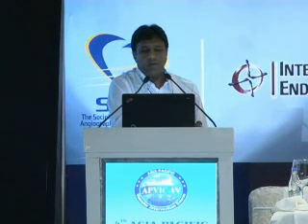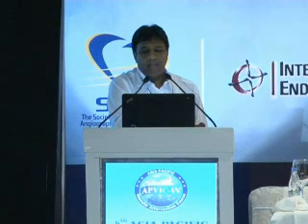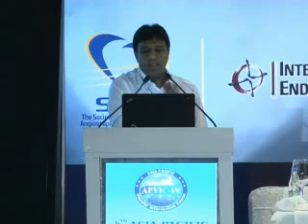These are the bare stents, and these are the covered stents. Covered stents and stent grafts are terms loosely used to describe metal stents that are either covered or lined with fabric, usually polytetrafluoroethylene, PTFE, the same material we use for grafts. Examples include the lined Viabahn, which is FDA approved for the superficial femoral artery. The addition of the fabric means a larger delivery system is involved. Benefits include the ability to treat aneurysms and perforations while maintaining lumen patency.